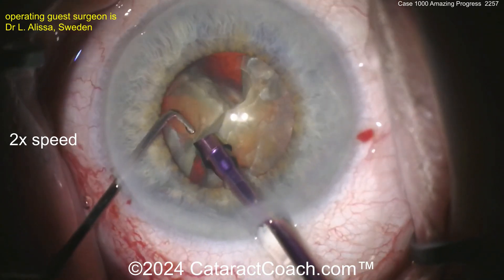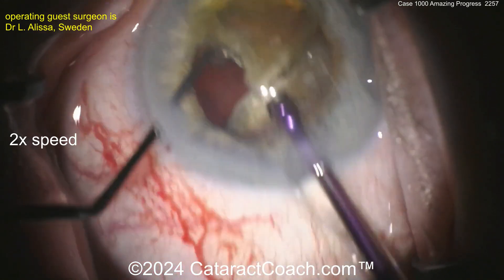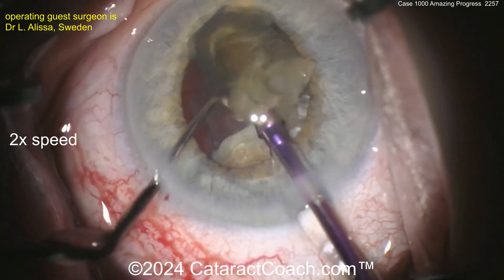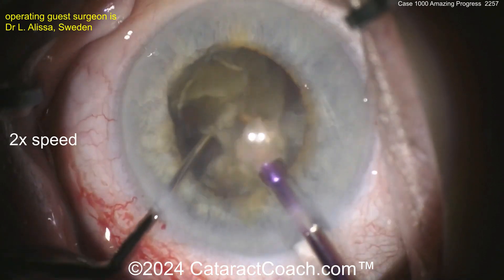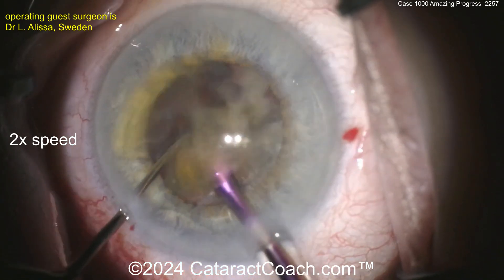Here are the pieces coming out. You can see the pupil is going to come down a little bit. Maybe this patient has IFIS — Flomax, Tamsulosin, something of this nature. Getting these pieces chopped and emulsified. We sped the video up; we just want to get through it in an efficient amount of time.